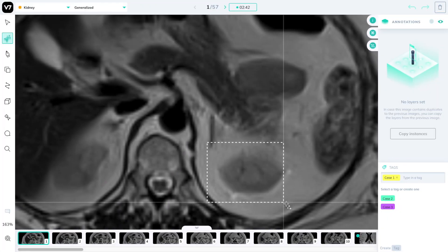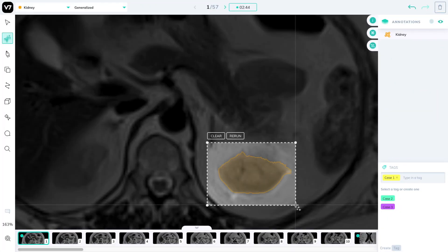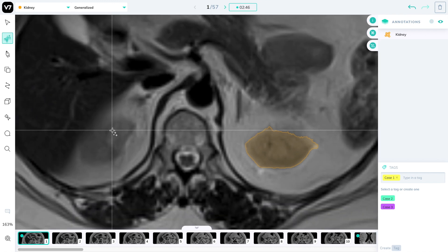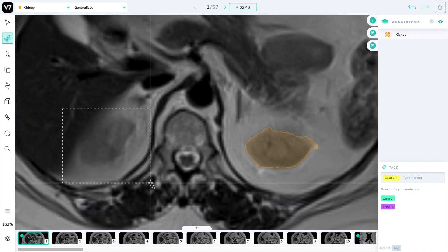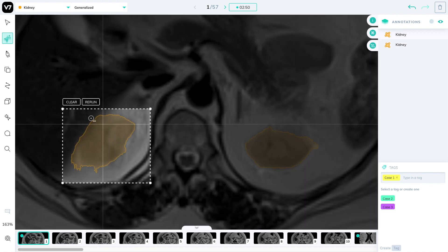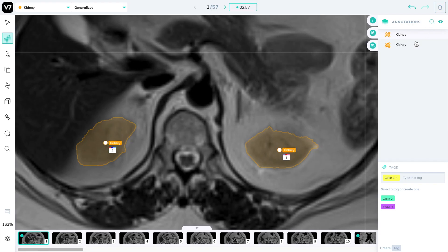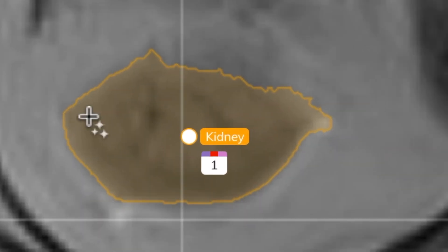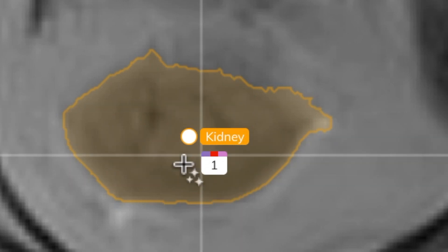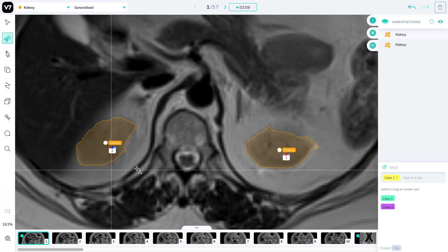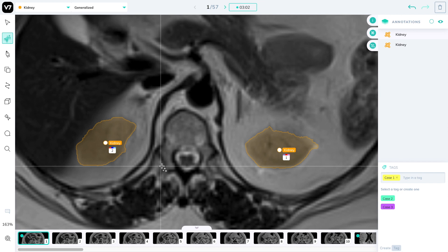Let's look at case number two. We simply have to segment the kidneys of this healthy patient. We'll create a couple of auto-annotations to exclude any unnecessary marks and then reveal the sub-annotations. This will show the instance ID of these kidneys — a unique number and color combination to indicate kidney number one and kidney number two. We can track these numbers throughout the various slices to show it's exactly the same organ.